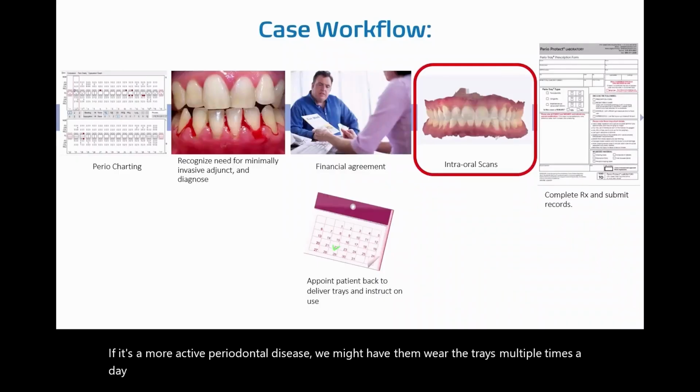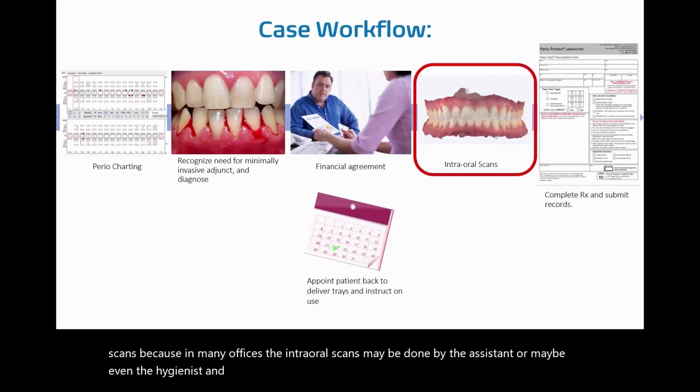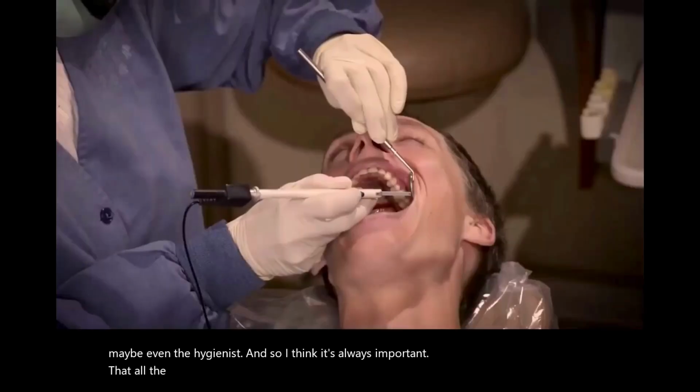But one of the things that we're going to really focus on during this program is intraoral scans, because in many offices, the intraoral scans may be done by the assistant or maybe even the hygienist. And so I think it's always important that all the team members understand what it is that we're looking for.